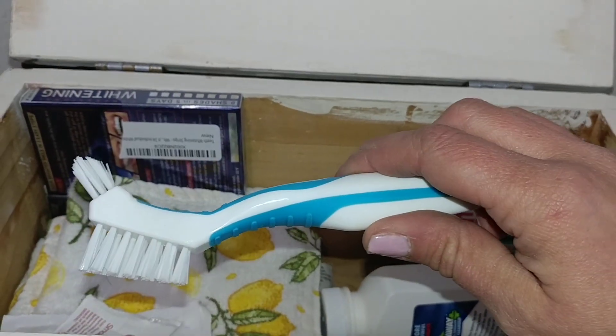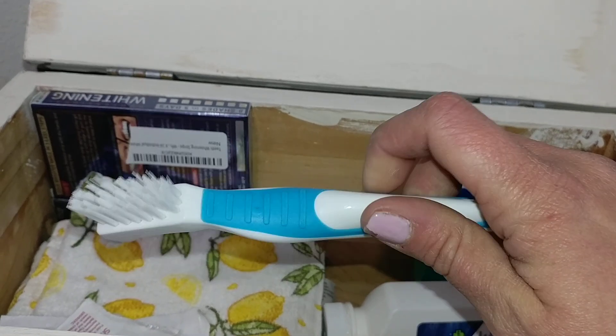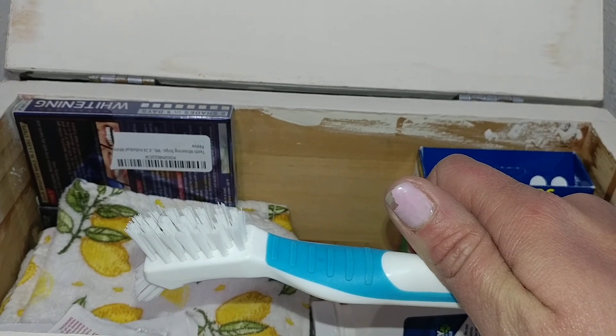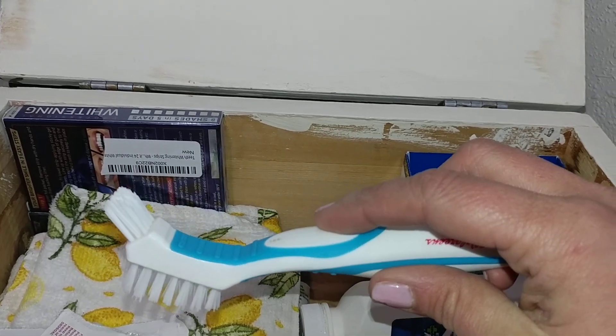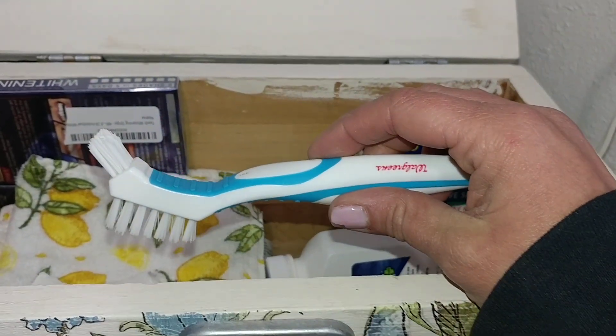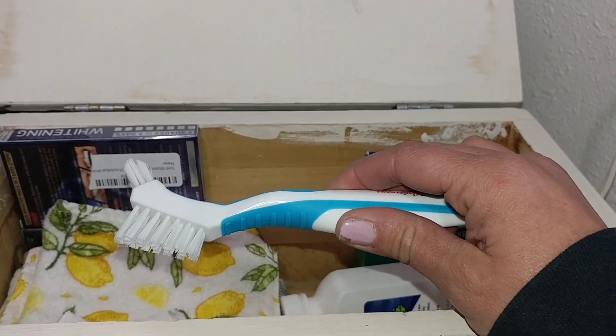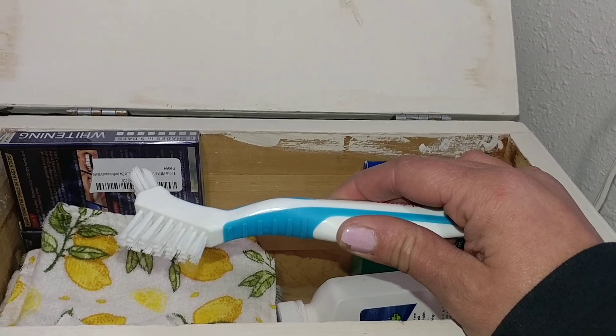I bought ahead of time a denture brush. This one's a lot bigger than the one the dentist gave me and I can really get in there when I'm cleaning my teeth. I really like this big one versus the small one. So you might ask your dentist what kind of accessories you're going to receive after you get your teeth, because I did not get much.